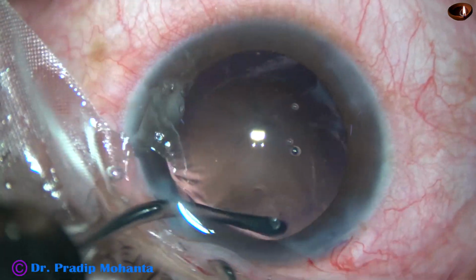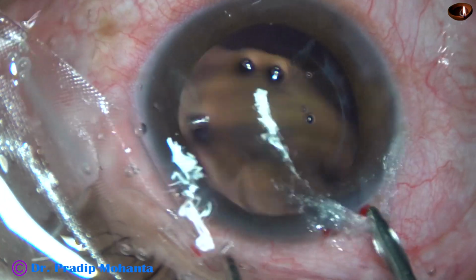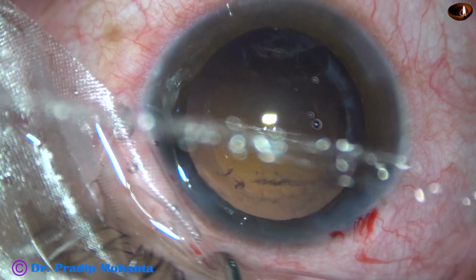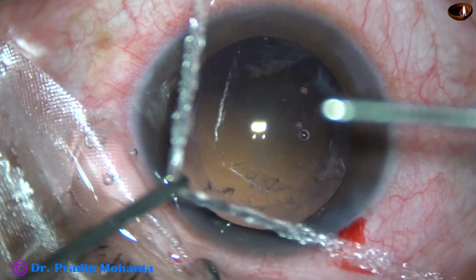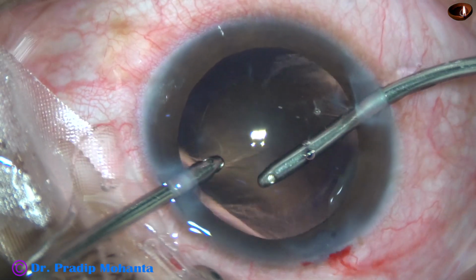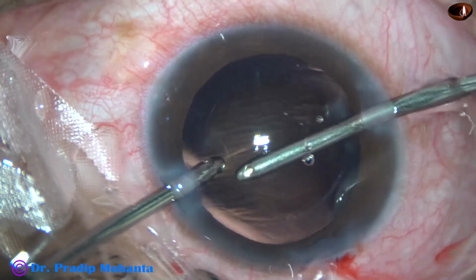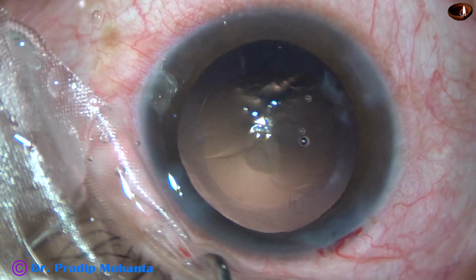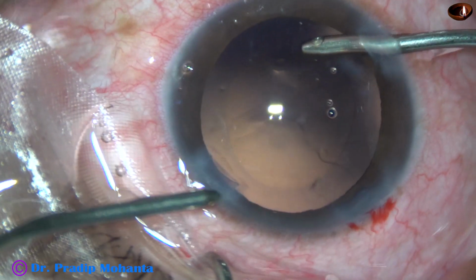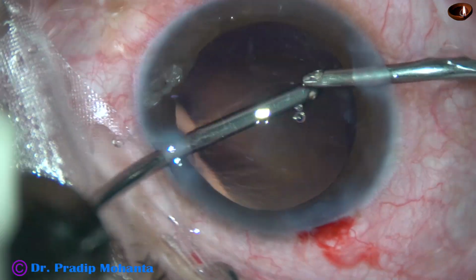And I am going to remove these cells by the capsular vacuum mode of the phaco machine, that is by IA2, where the vacuum is only 50 mm of mercury and flow rate is 25. So 25 ml per minute flow rate and 50 mm of mercury vacuum. This has been used to polish the posterior capsule, to remove the cells that were sticking to the posterior capsule.